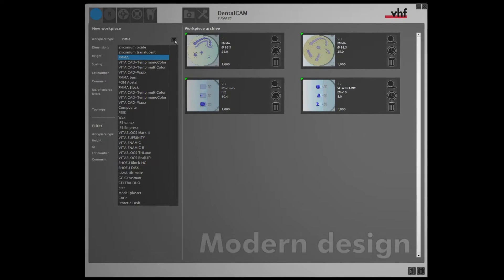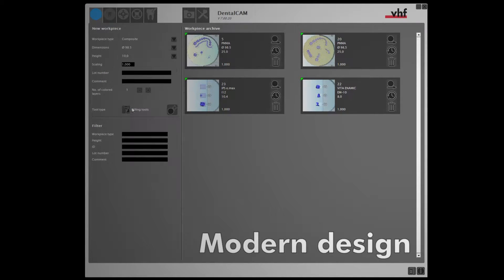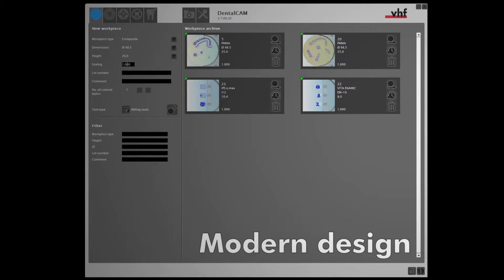With its modern design and updated interface, DENTAL CAM 7 requires minimal retraining, as many of the features that you've come to know and love have remained the same.